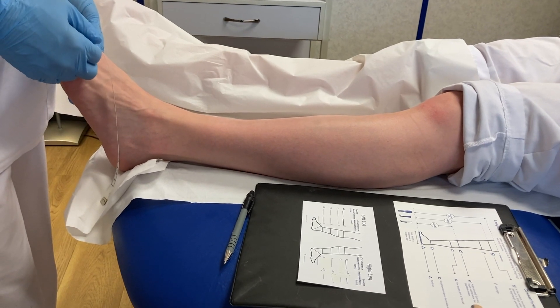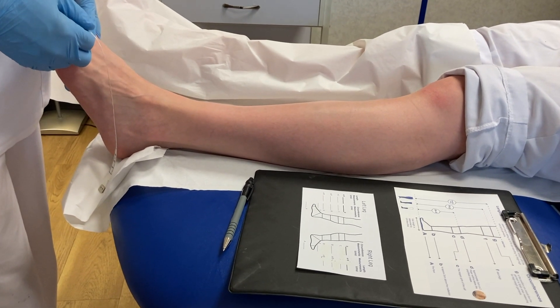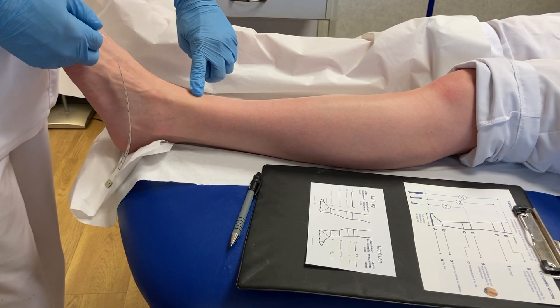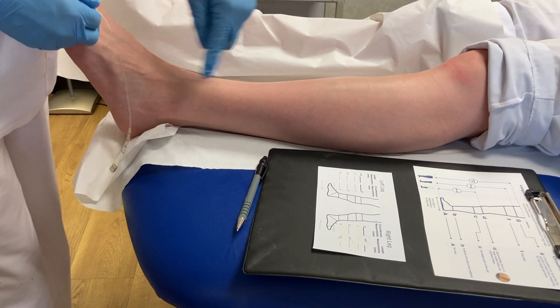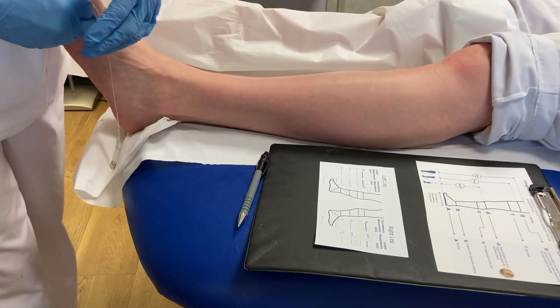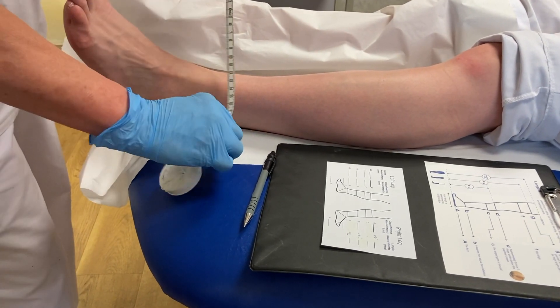To get a perfect garment fit, we need to take two measurements: one around the ankle, just above the ankle bone, and one around the widest part of the calf. We then take a length measurement, which will give a perfect fitting garment.